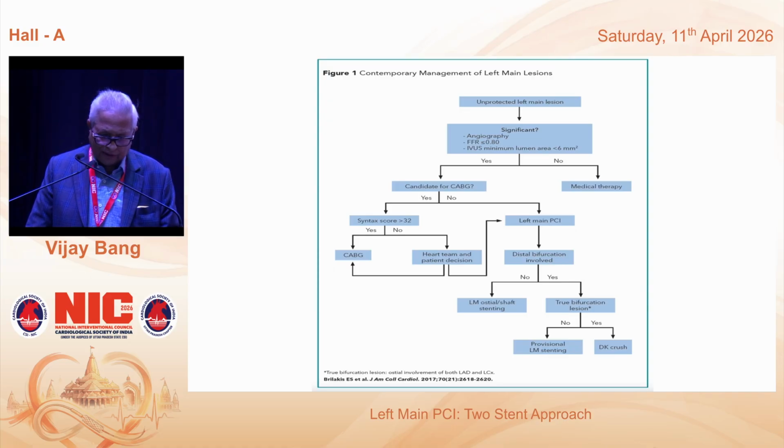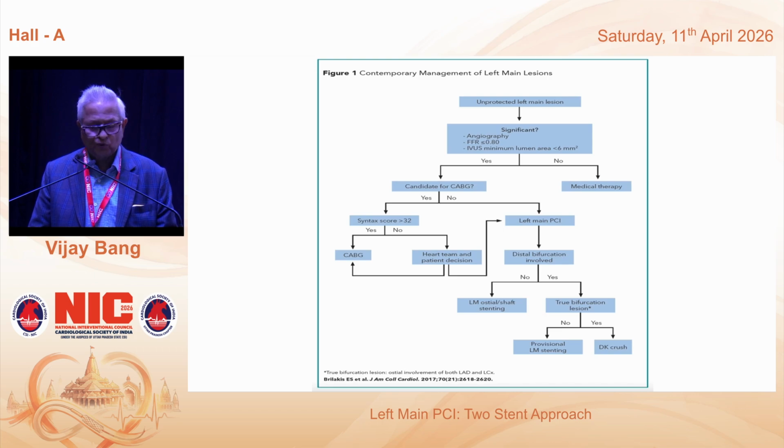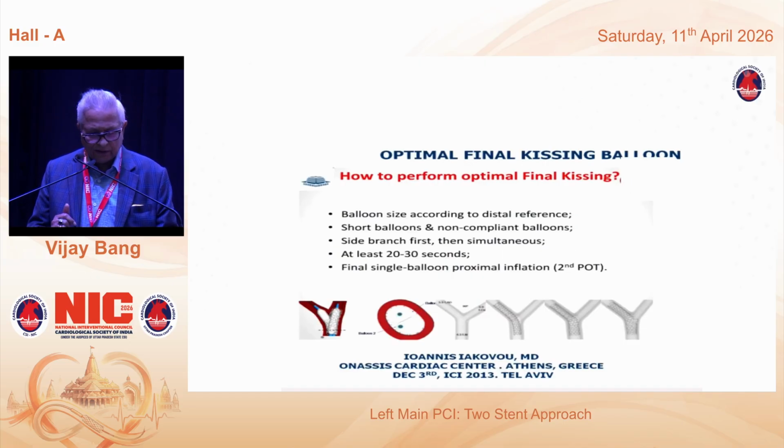All this is very important, because all the trials have proven that DK crush upfront is very good for true bifurcation lesion, and for bailout, all the techniques are available, and the best results in bailout are with either TAP or culotte.